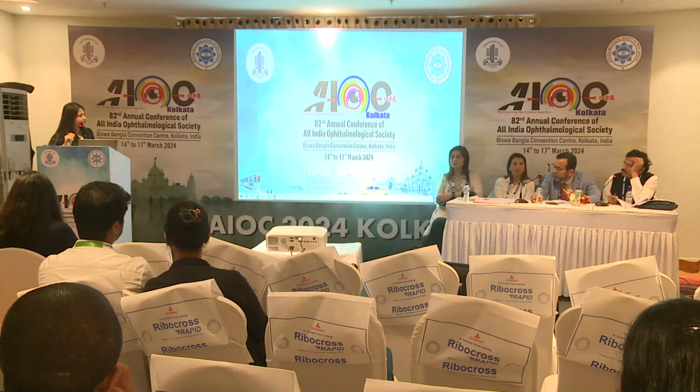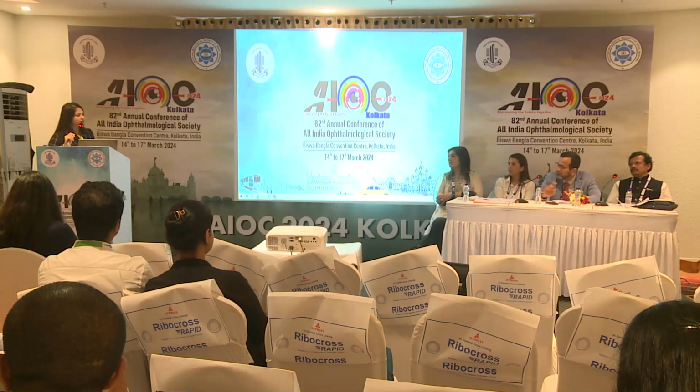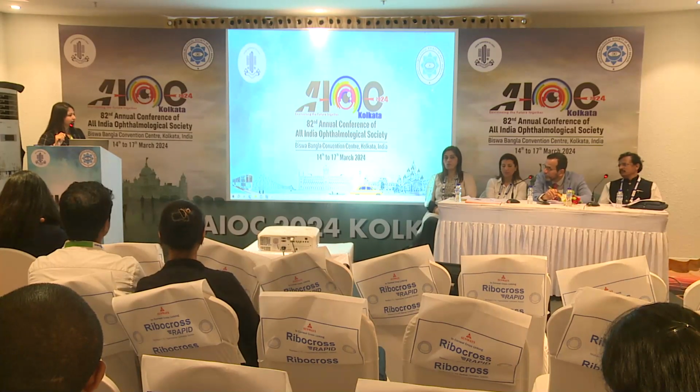So in conclusion, which would be a better technique? What would you advise people to do, use a viscoelastic or not use a viscoelastic? Viscoelastic is useful in the initial learning period. But you said the study was done during the learning period itself, even for the hydro group. Yes, sir. At the end of it, would you advise a shift from the viscoelastic? I would advise the shift from the viscoelastic to the hydro.